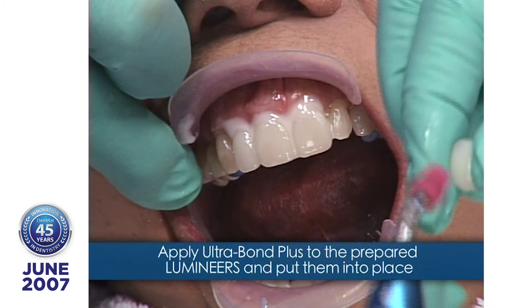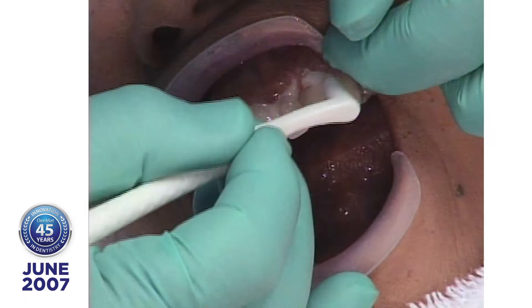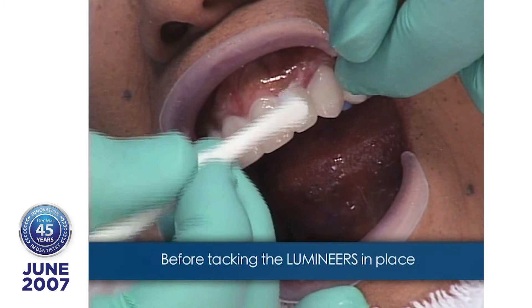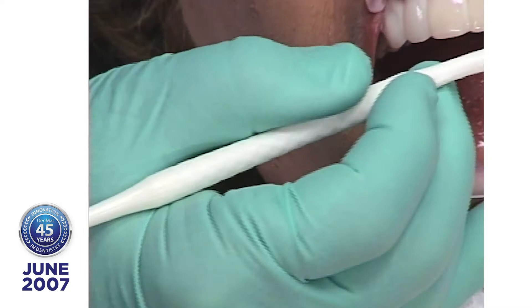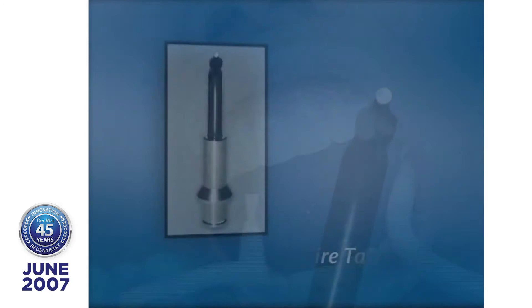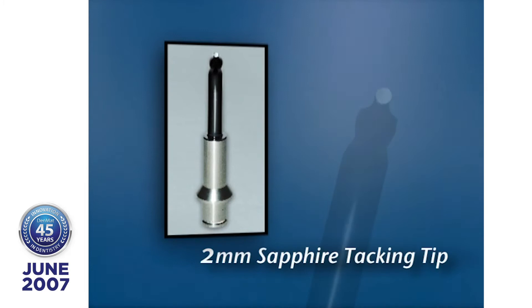I had a dentist that did his first Lumineer case tell me — showed me what a great result he got — but he said, you know, I like to take off the tooth structure. He said it was a little messy cleaning all this up. And I said, well, remember, you didn't do any preparation and you didn't do any temporaries. Now we'll take the two-millimeter tip for one second and spot cure each tooth so they won't float around when I come in with the five-second cure.